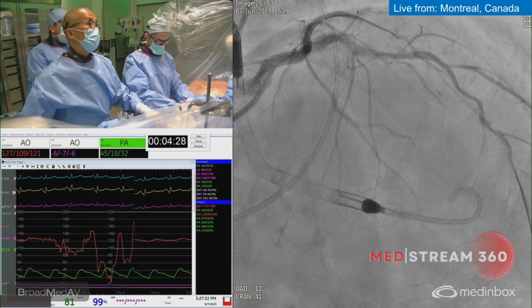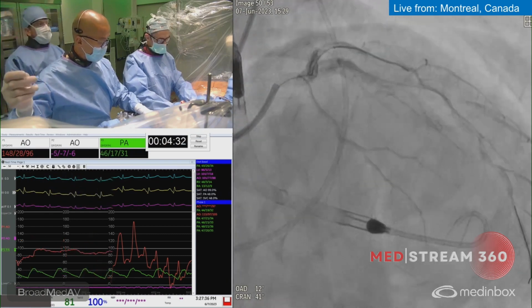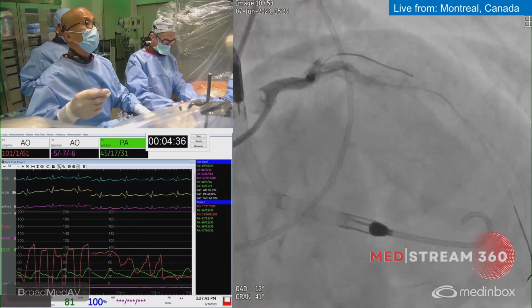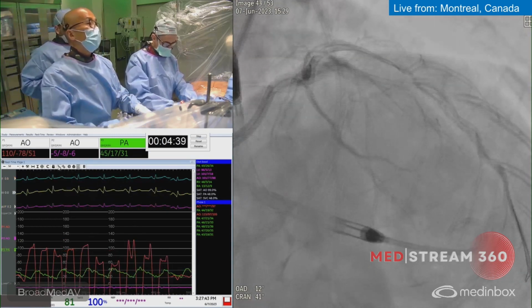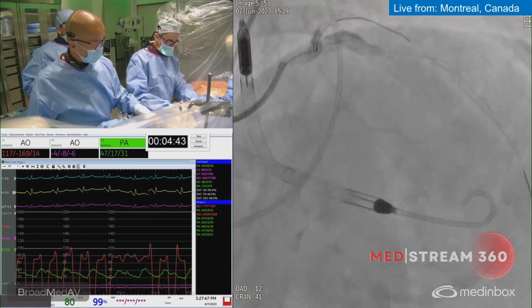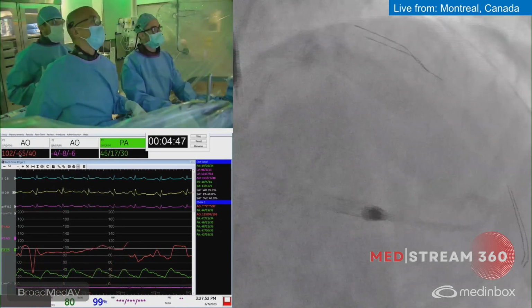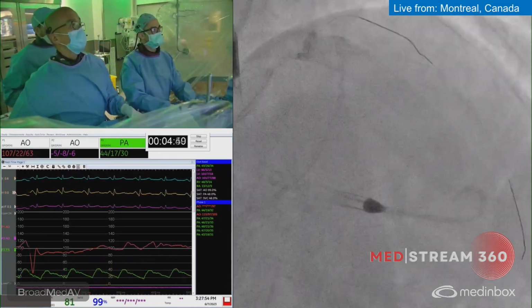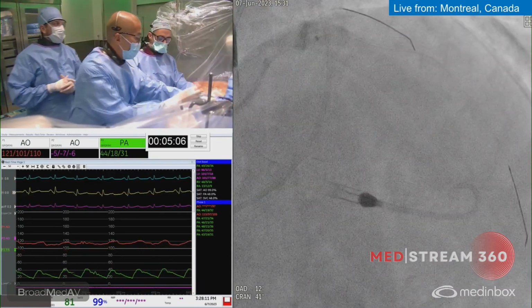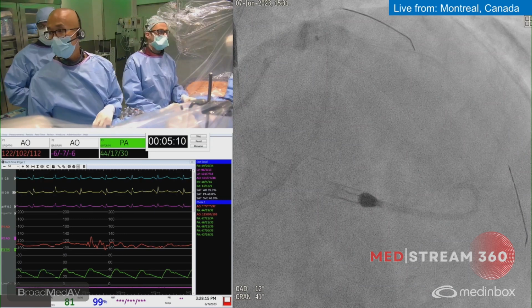You know, it's important to really modify the calcium. We were confident that it was okay. However, there might be some small spicules and the balloon ruptured. So that tells us that at least in the extra plaque space, this happened probably in the left main bifurcation, so we're already expecting we're probably going to have good expansion. Okay, we'll see. We don't want to inject anymore because we have a dissection. So we'll just use the stent. We'll get our roadmap to coordinate the deployment of the stent in the mid.